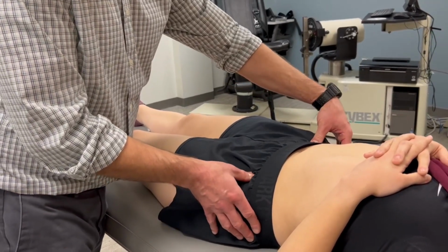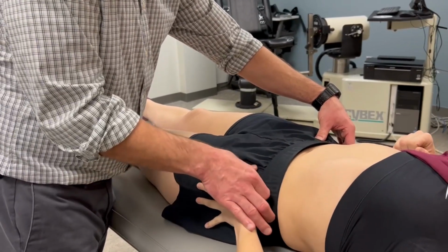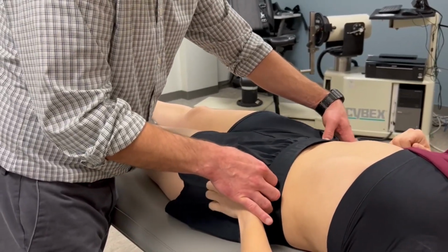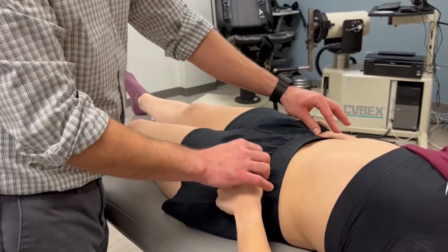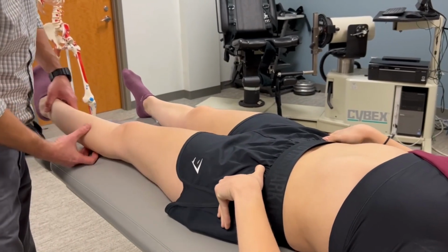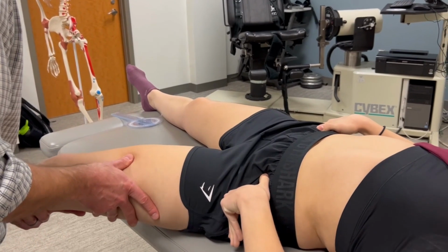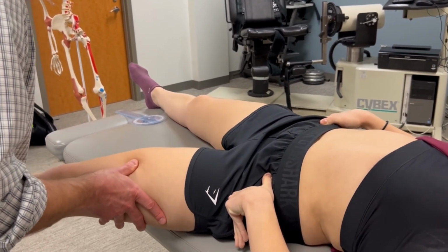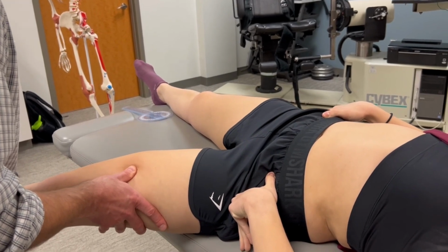You can also ask the patient to help when you're taking your measurement, to put your thumb right there and then point your other thumb right there. That will help you to better visualize that line connecting both ASIS. Let's bring the hip into abduction. Right about there, I start to feel some passive tissue resistance.